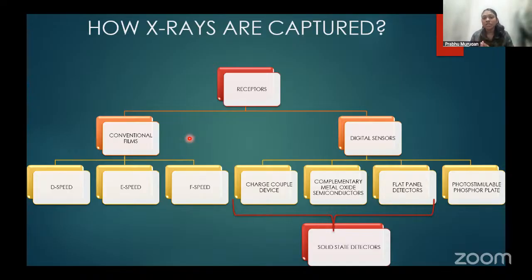When it comes to digital X-rays, we call the films sensors. These are the digital sensors that capture the incoming X-rays and give you the final image to be viewed on the monitor.